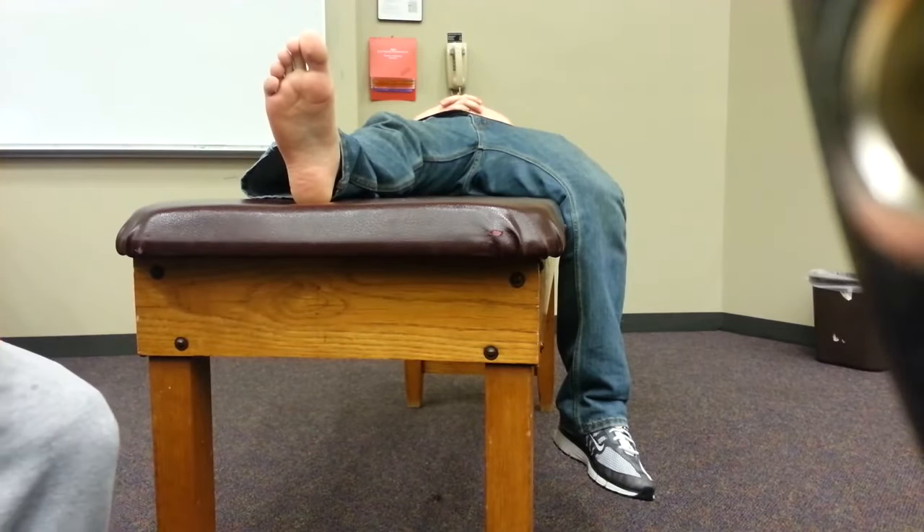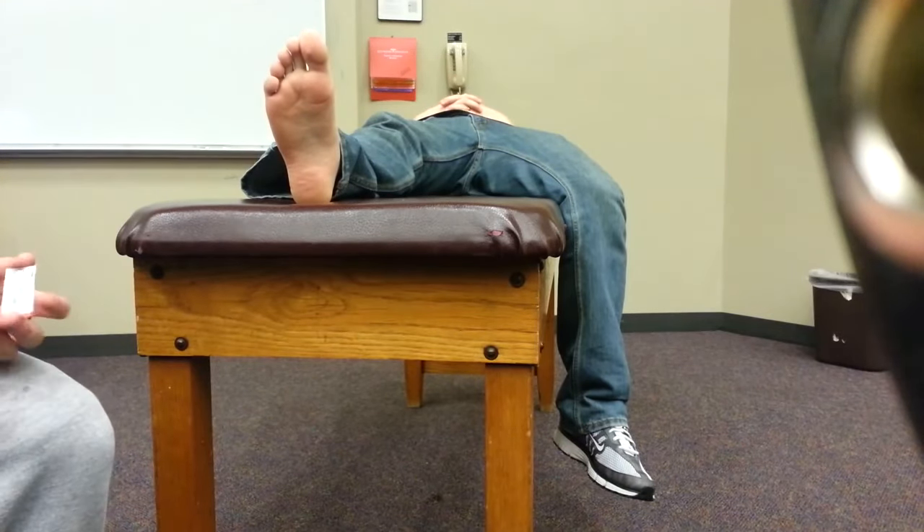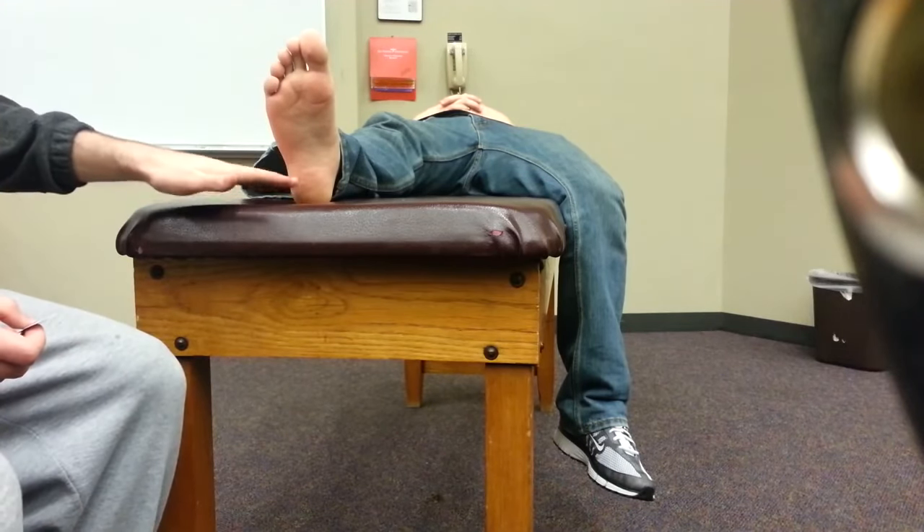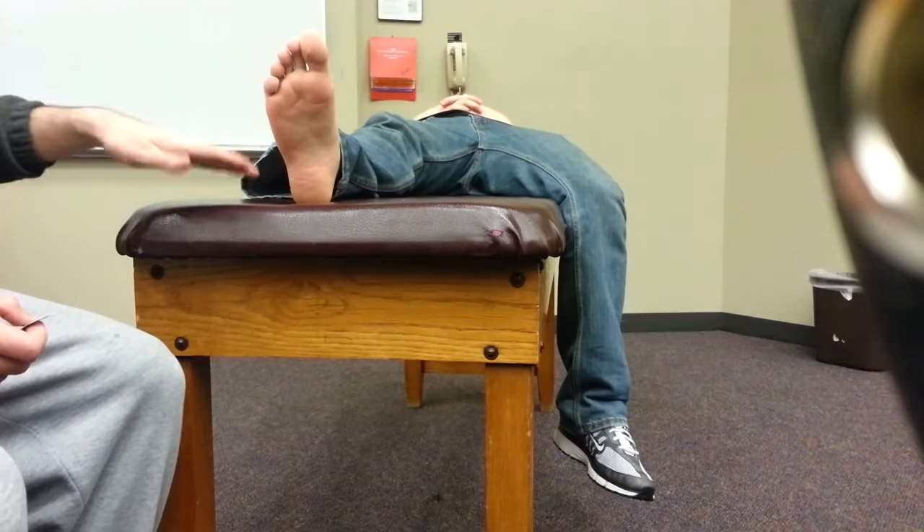When a patient comes in with suspected diabetic neuropathy, you can perform a monofilament test. For the monofilament test, you're going to be assessing ten different locations within the diabetic individual's foot.